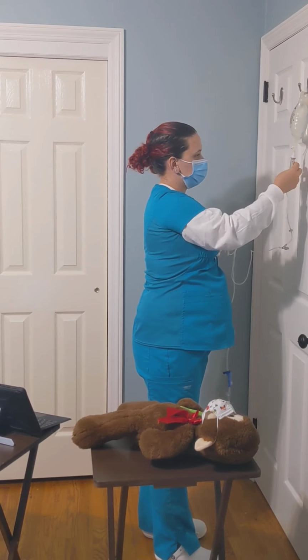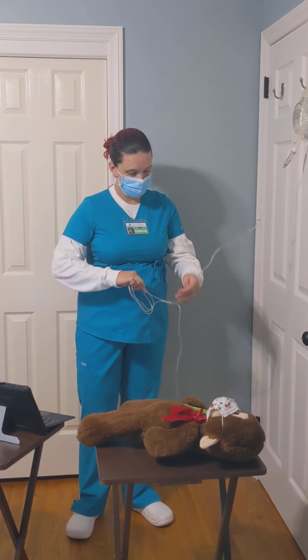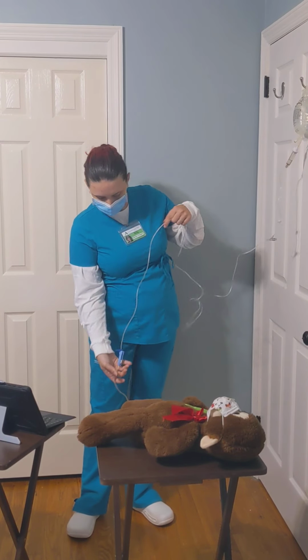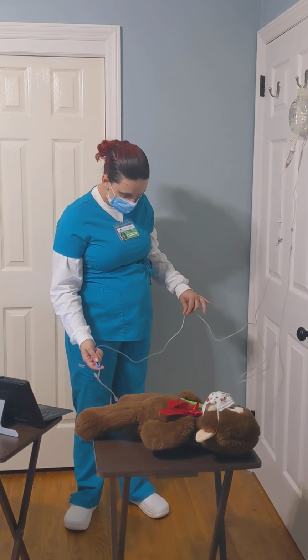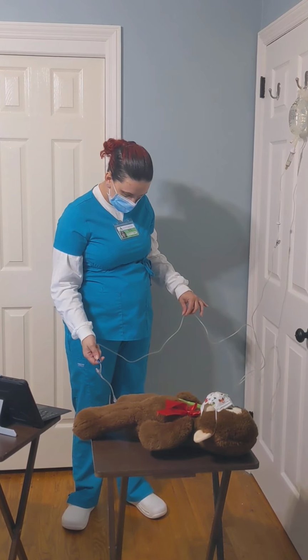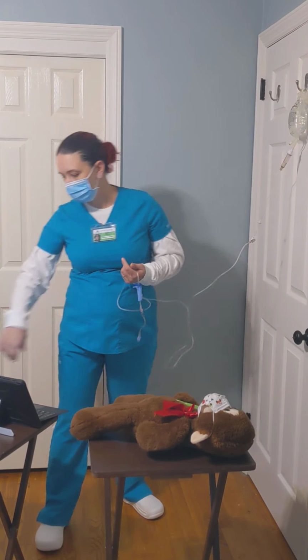Going to fill the drip chamber up partially to the line. And we are going to prime this tubing slowly so you don't get any bubbles. Okay. I'm also going to label this tubing with the date and time that we have hung it.